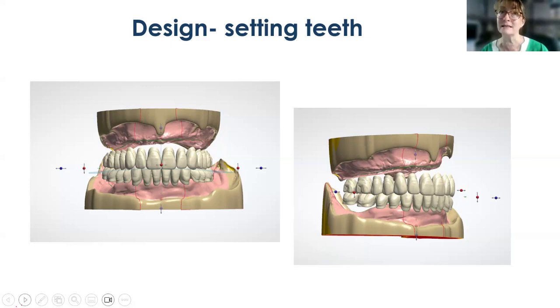And then again, as a dentist, do you like to sort of put your fingerprint on a try-in and get the wax instrument and the Bunsen burner out and make some adjustments to the wax try-in yourself? Is that important to you? If it is, then you should probably stay with wax. If it isn't something you necessarily do, then I would encourage you to try a printed try-in.